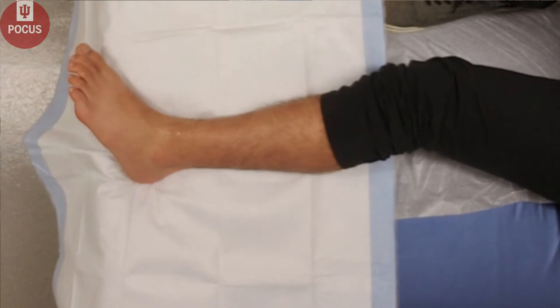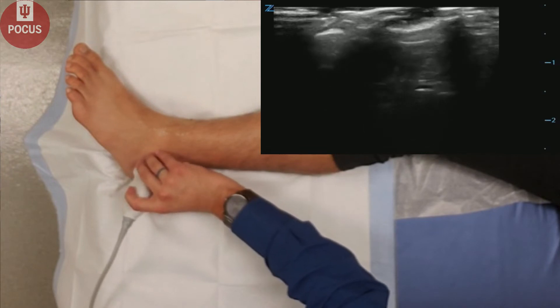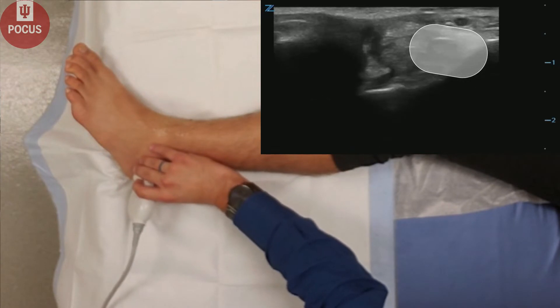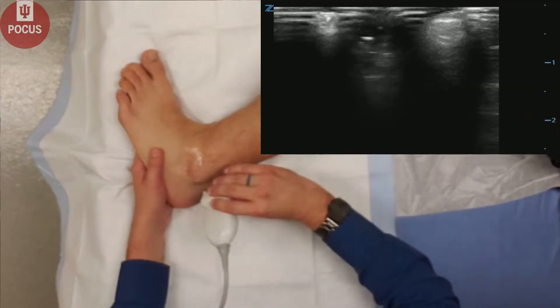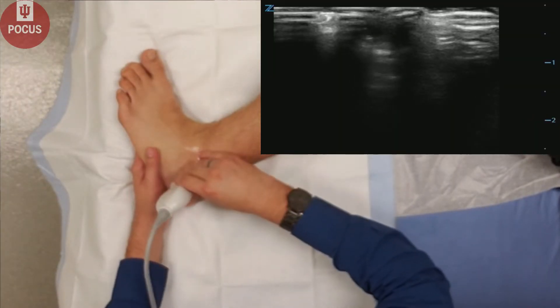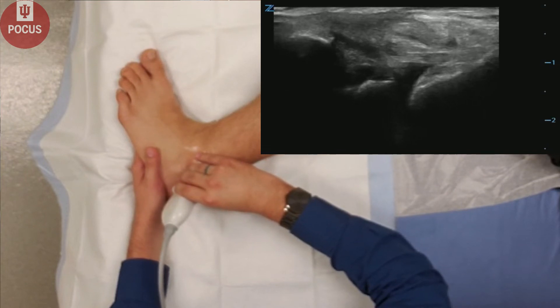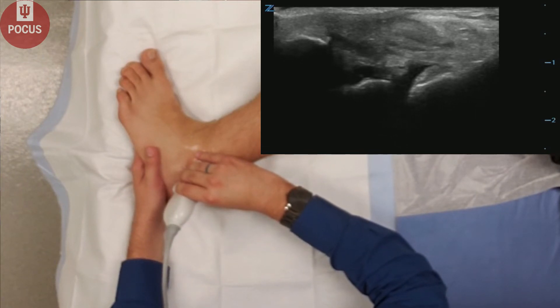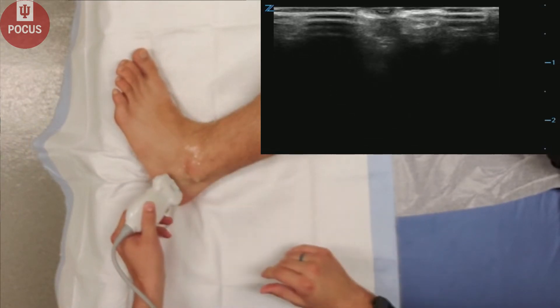Next, we'll have our patient roll the ankle to the side so we can look at the lateral ankle, and we can see the peroneus tendons in short axis here. Then we want to put quite a bit of ankle inversion, and we can make out the calcaneal fibular ligament, which rests right below the fibular tendons on the lateral side of the ankle — another common site of ankle sprains or tears.